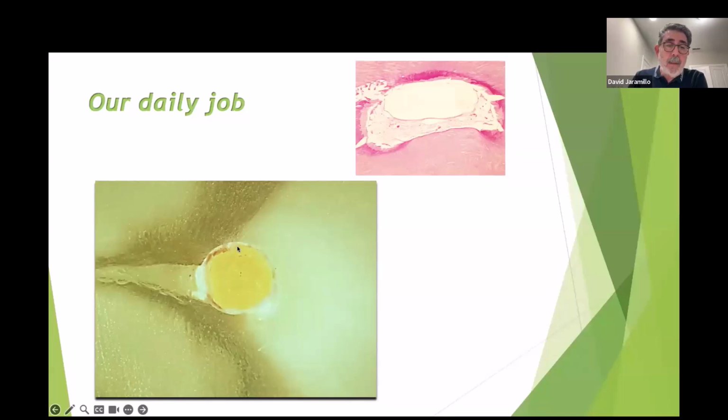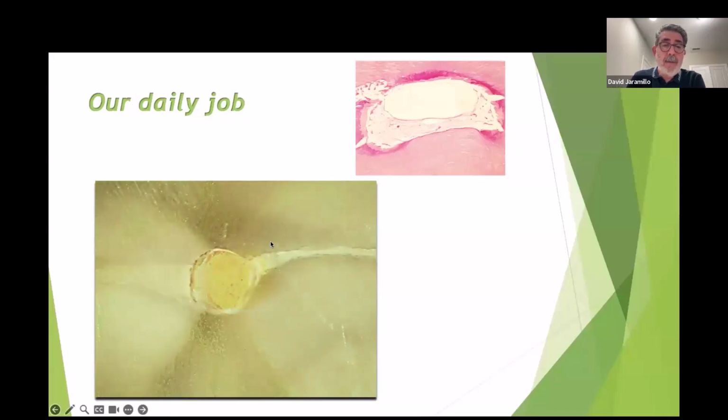right? The voice really doesn't bother me much. This is BC sealer, but look inside the isthmus. This is debris. This is debris that we're not going to be able to remove. It doesn't matter if we use ultrasonic or laser or the GentleWave clean, the hydrodynamic cavitation.